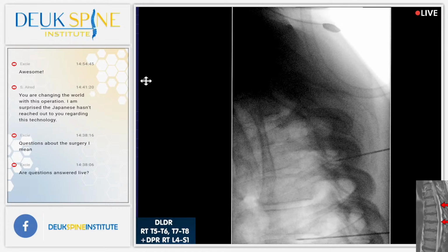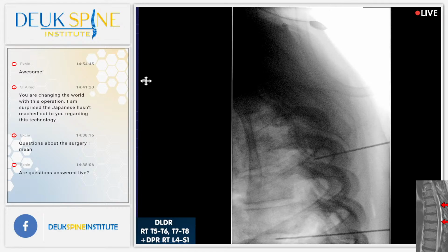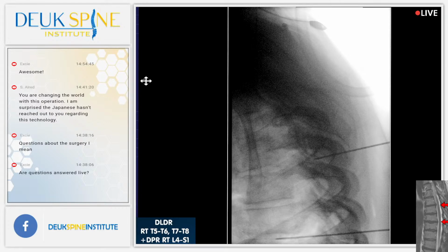Actually, that to me looks a little better with respect to the back of the vertebral body. Maybe try a little more. Maybe we're going too far. Shot. All right, well, whatever you did, the back of 6 to me looks, I don't know if it's worse. I think it might be better. Let's try. In a way, it looks worse, but let's try a little more and see what happens.